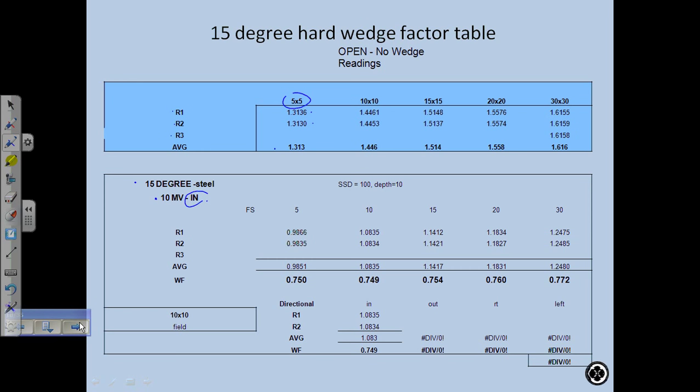Gantry. If you're looking at the gantry now and you put a right wedge in, where's the toe? Right. Does everybody agree with that? I think it's the patient's right, if it's head first supine. Yeah, if the patient's head first supine, it's the patient's right. Not your right.